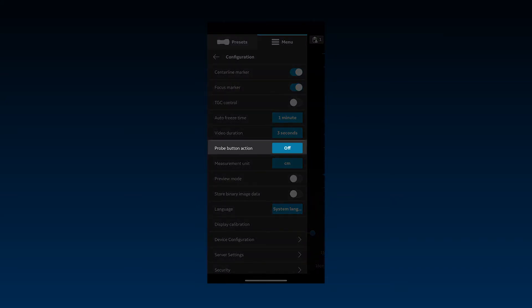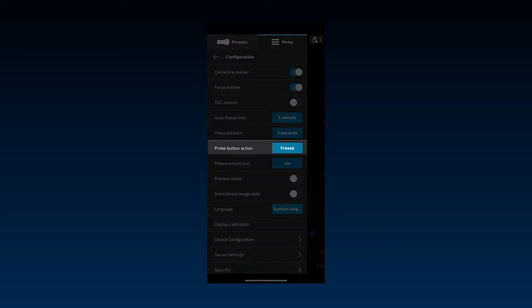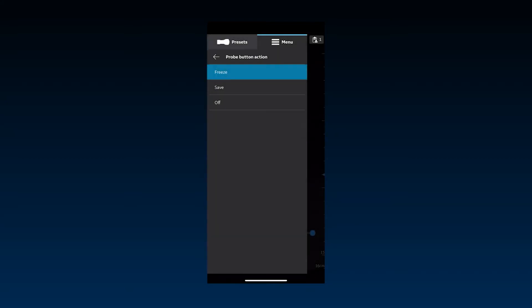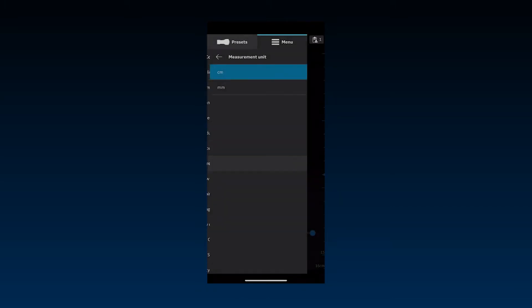The power button on the vScan Air probe can be configured for additional functionality such as freeze or save. This can be useful to eliminate the need to touch the display device during procedures. If you do not want to use any actions, simply select off from the power button. The measurement unit can be defaulted to centimeters or millimeters.